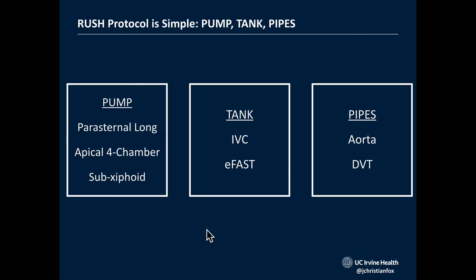And yeah, you're switching probes a lot, which is why it's nice to have a triple transducer connector, have a way to quickly switch between the probes without having to disconnect them and reconnect them. So in most clinical areas, certainly in our resuscitation bays, we have those. All the probes are always connected and always fired up, ready to go at any time. And that really makes doing a rush protocol like that in the resuscitation bay much, much faster.